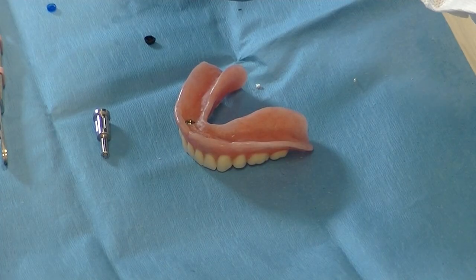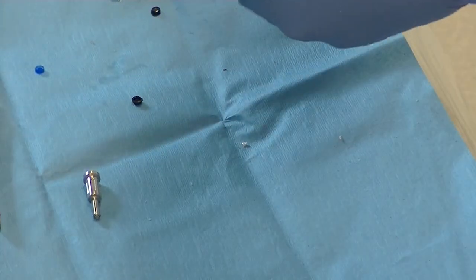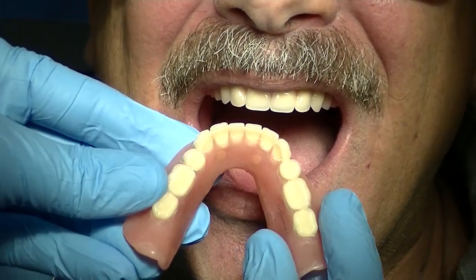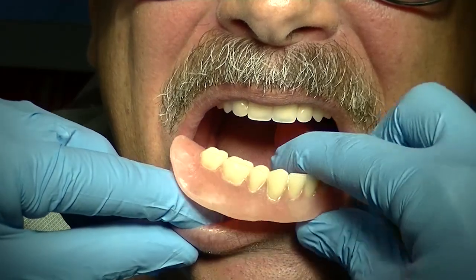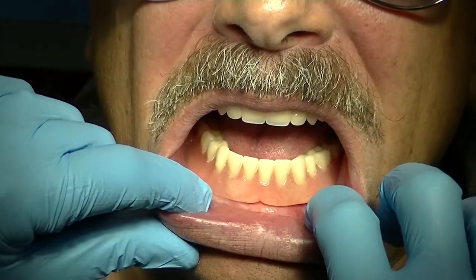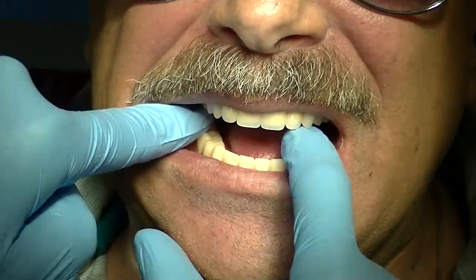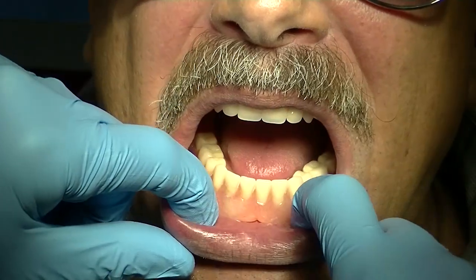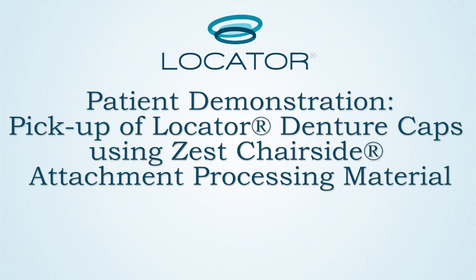Now we're going to be removing the processing males and inserting the blue nylon inserts that the patient will be wearing. The blue male inserts are present within the denture. I'm going to be snapping that back onto the implants, verifying that I have adequate retention and stability. The patient generally feels it right away that things start to feel really pretty nice. I'm going to be testing anterior-posterior as well as lateral motions to verify adequate retention and stability. Tongue is going to be moving around verifying that I have good stability. That concludes my patient demonstration of utilizing the Zest Chair Side Attachment Processing material. This is Michael Shearer — thank you for tuning in to LearnLocator.